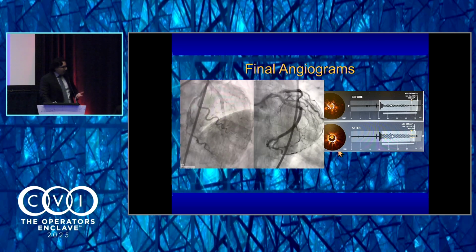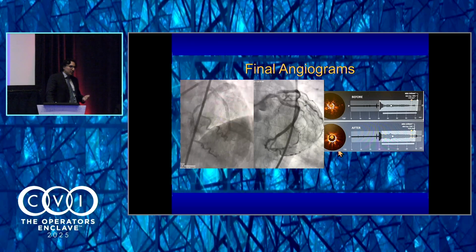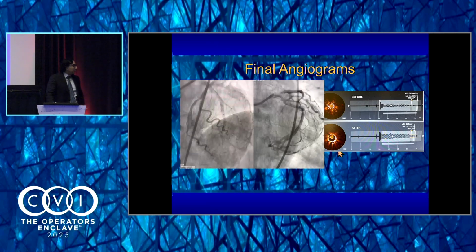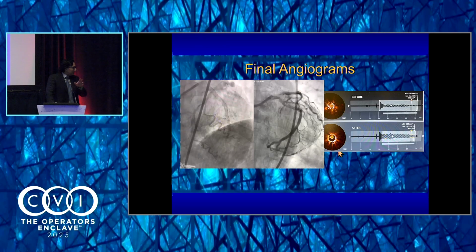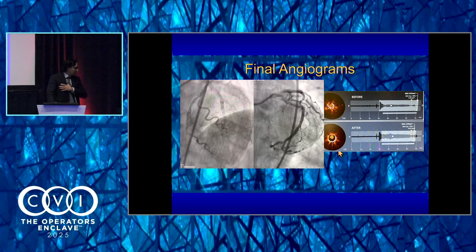Now, the things I was going through here, I even got contralateral access in the other groin, thinking, God forbid, there's a perforation, I'm going to need to put an Impella right away, and this and that. So maybe I was a little bit conservative in my approach with the OPN and pre-dilating.